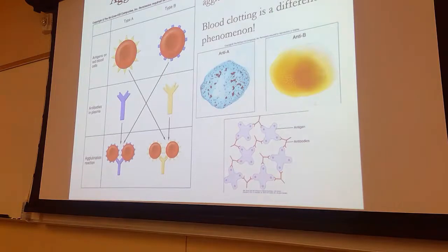So here's last semester's blood from me. You're going to take my blood, and I'm going to give you droplets. 3 drops, and I'm going to put those 3 drops on a slide.